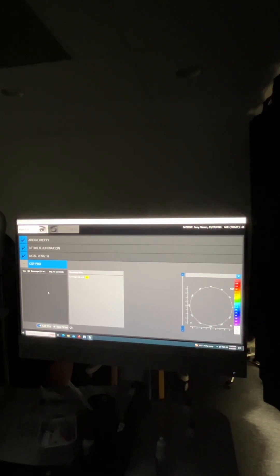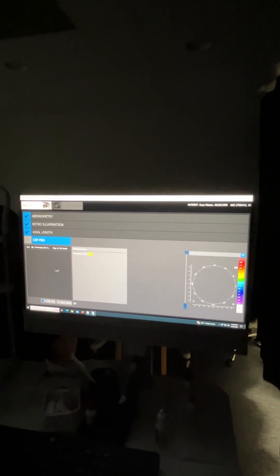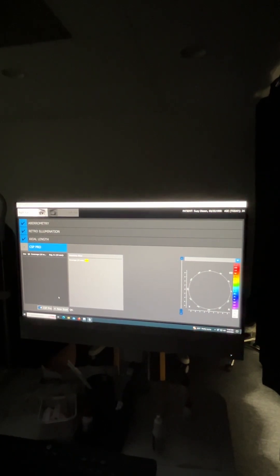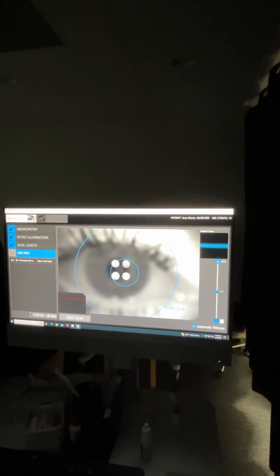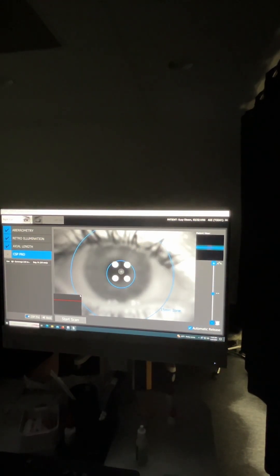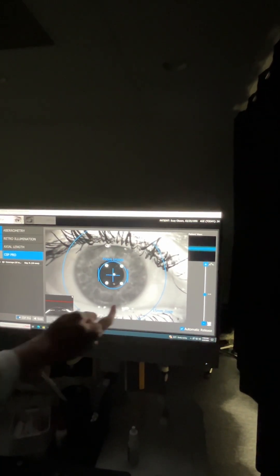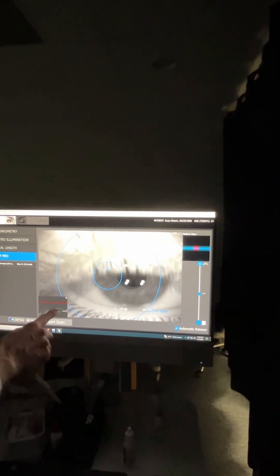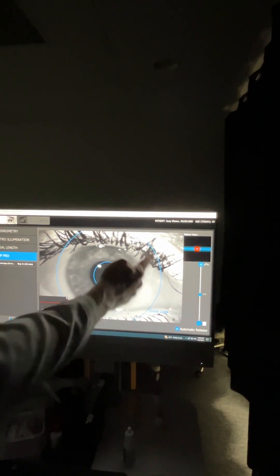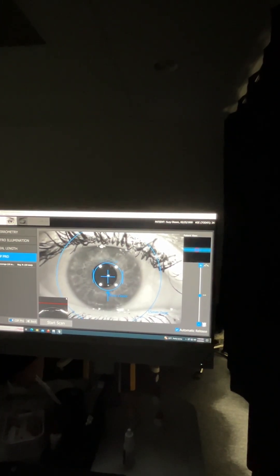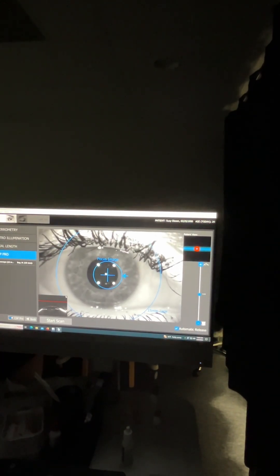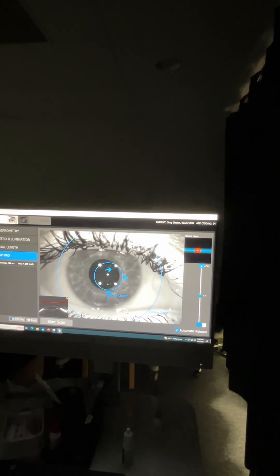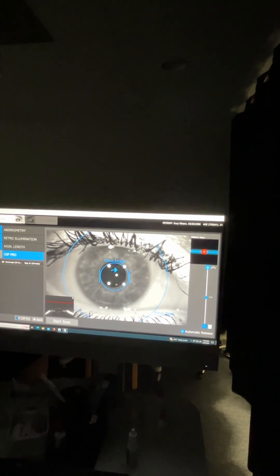We are not going to do that one right now, but we can circle back to that. But ultimately if you just rest your chin in there, you hit new scan. Otherwise it's going to look the same. The only difference on this one versus before, as you see, there's now an additional blue line to the side. Everything in the middle looks exactly the same. Even over here, it looks the same. Their fixation is the same, but what's different is this blue 15 millimeter zone. And ultimately what you want to try to do is get the eyelid outside of that, whether that's with an additional person or with an eyelid speculum. If you're going to do something like that, then it's advised that we use some anesthetic eye drops. We're not going to take this one for you right now.